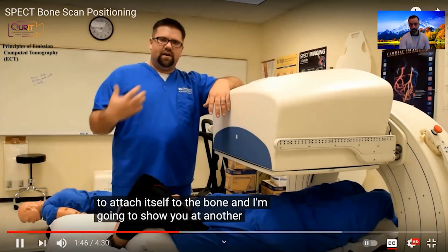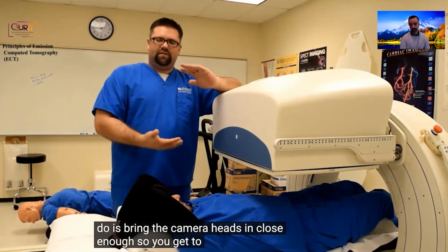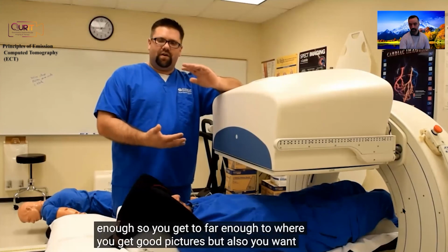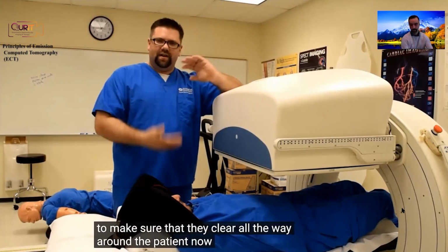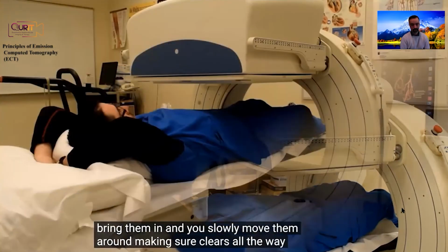And I'm going to show you in another angle. Basically, you're going to want to bring the camera heads in close enough so you get good pictures, but also make sure that they clear all the way around the patient. To do that, you bring them in and you slowly move them around, making sure it clears all the way around.